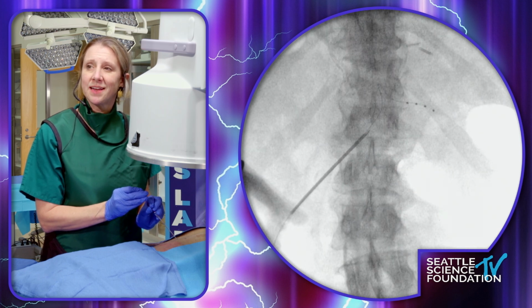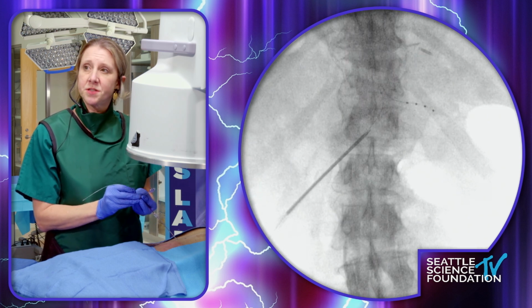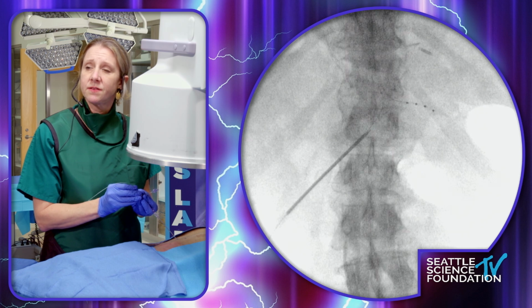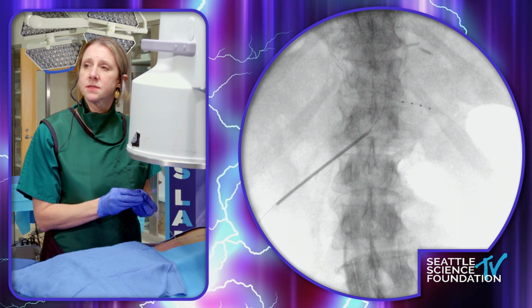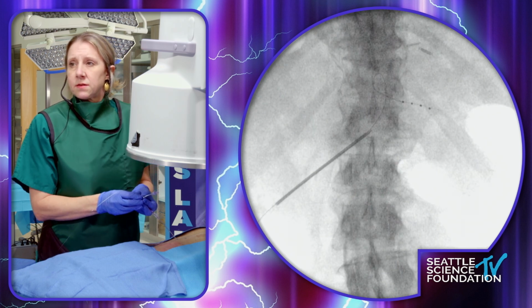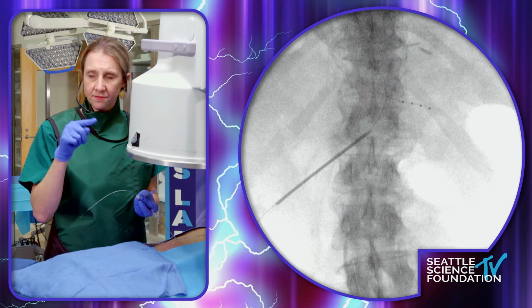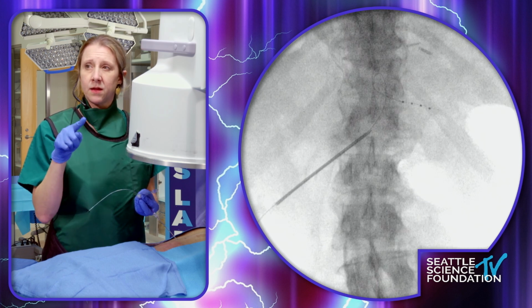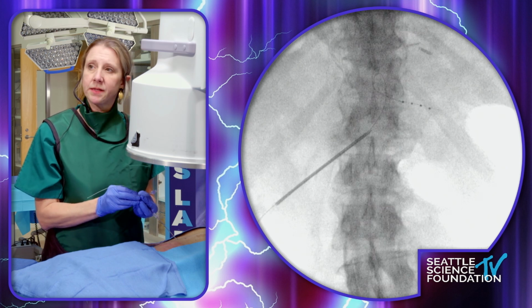So what I'm observing is that it's having a tendency to flip. Stop, please. What I want to do is try to advance the lead itself. So I'm unscrewing. Actually, I can leave the hub screwed down, but advance the lead live. So what I'm trying to do at this moment is create a superior loop. Stop. And what's happening is that loop is flipping. In an ideal situation, it would be a hump, not like a coil like you're seeing now. So I'm going to withdraw my lead live.